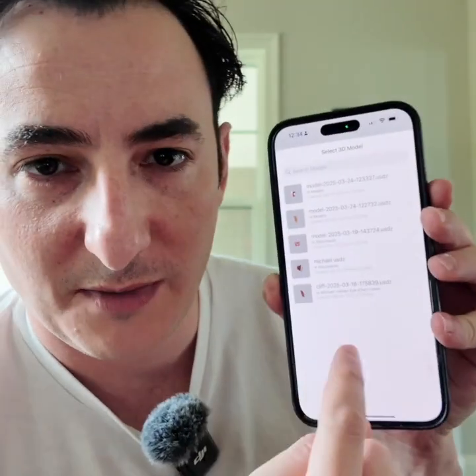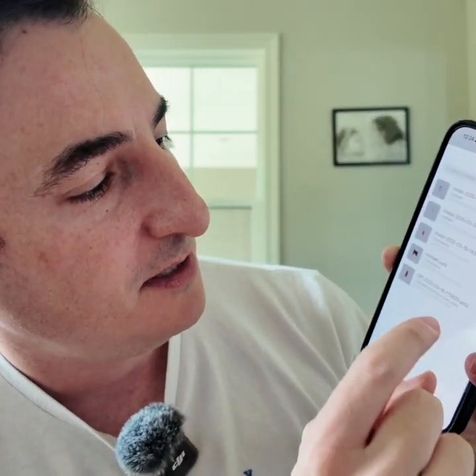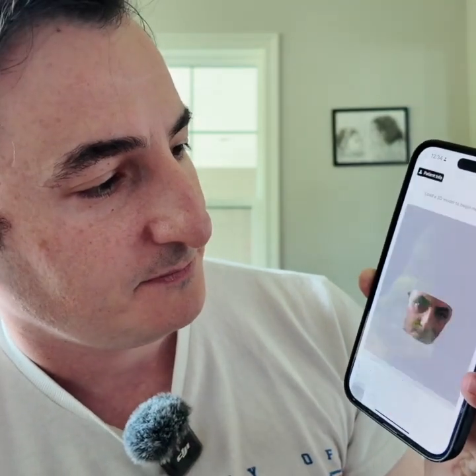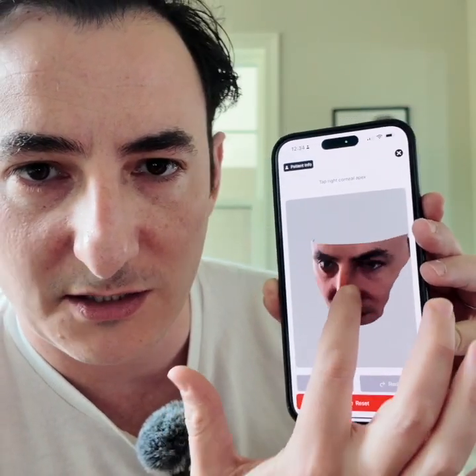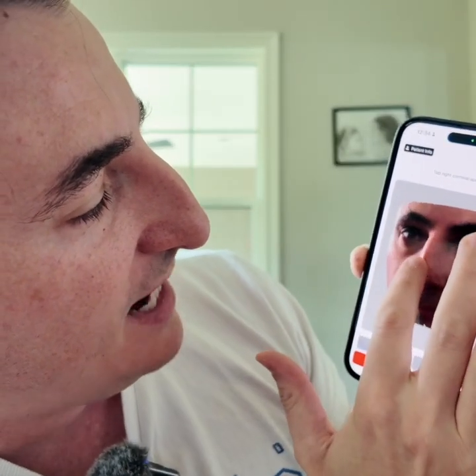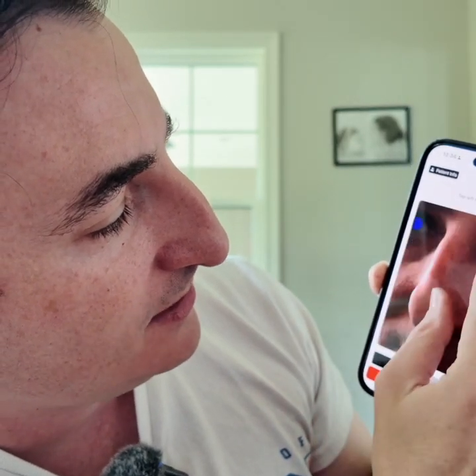Then I find the model. All the models — you can see a preview in the thumbnail and you can also search for them. This is the one that was just created, so I'll tap this. This is my 3D model, created using that scan. You follow the instructions: tap the right corneal apex and then tap the left corneal apex.